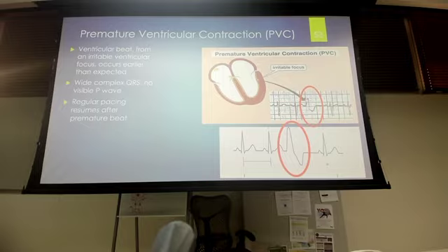But what you're going to see for the ventricles is that wide, in-your-face QRS. It just looks like it hurts. These patients often will come in complaining that their heartbeat is really hard. They feel like it's beating in their throat, because the ventricles are beating earlier than normal, and it's a pretty significant heartbeat. So: wide, bizarre QRS, and it's occurring earlier, so premature ventricular contraction.